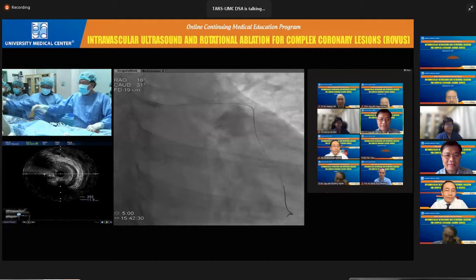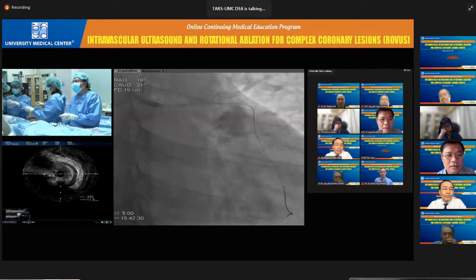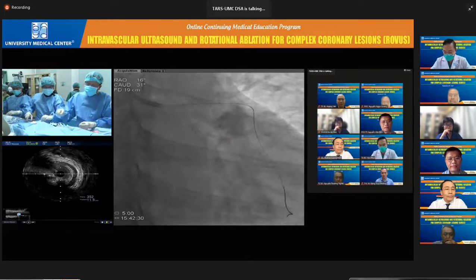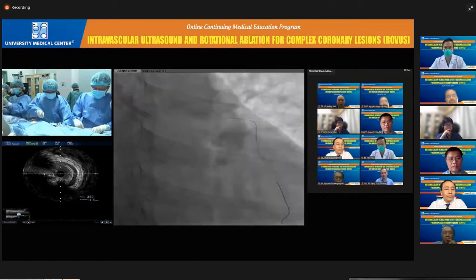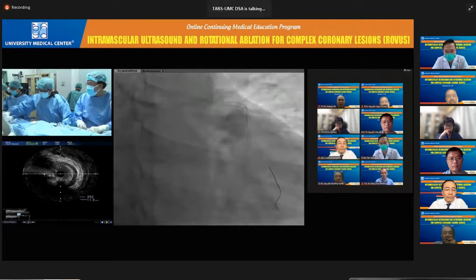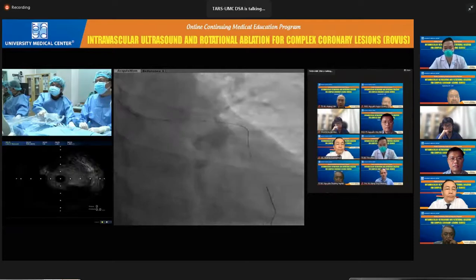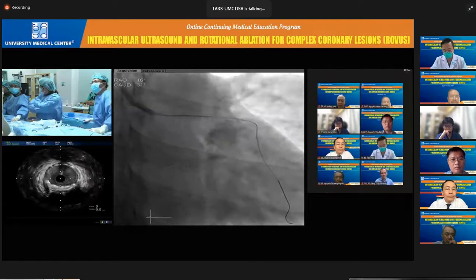So I just make the support, I hope that after this balloon dilatation, the cross position from the circumflex stent to the left main may be better. I would like to prepare the lesion before we do kissing for the DK crush technique. So first, it is important with the DK crush or other techniques, because we have to make sure that everything we do is perfect for the patient and for the lesion.